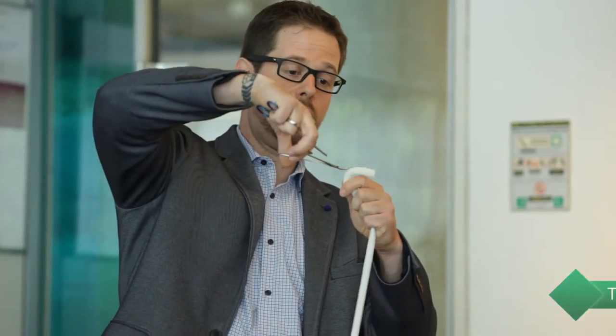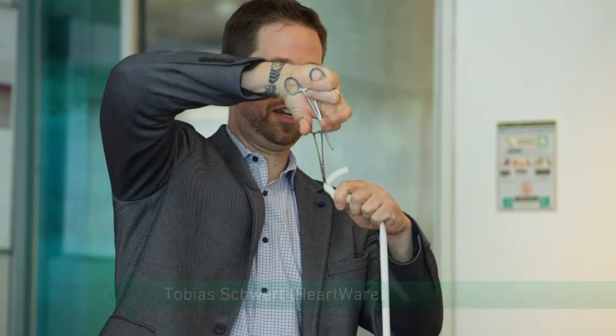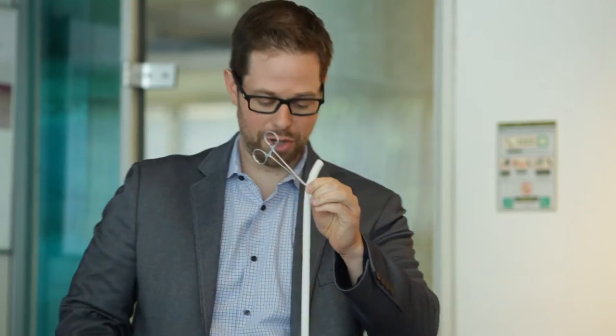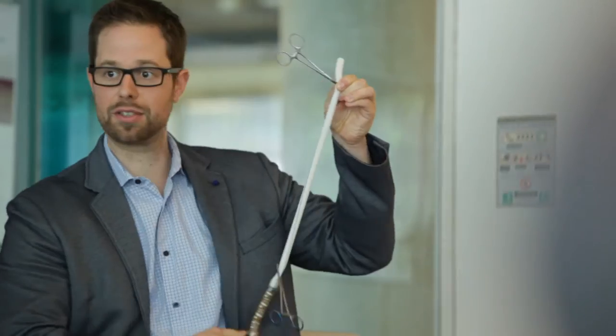So this is a C-clamp. Here's my aortic arch — C-clamp partially clamped, and now my aorta is closed. Just for your reference in this situation: the pump is implanted in the LV and the second clamp is here.